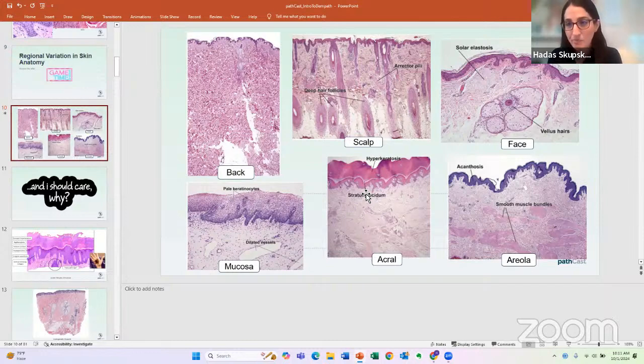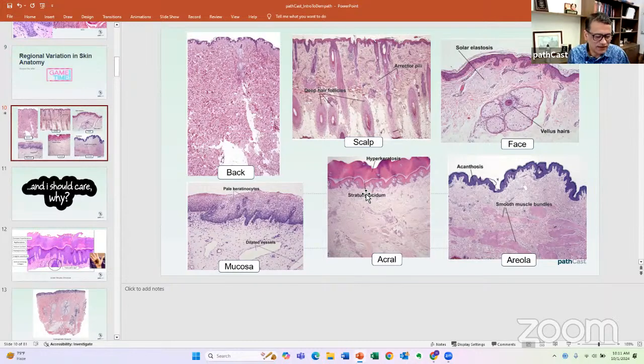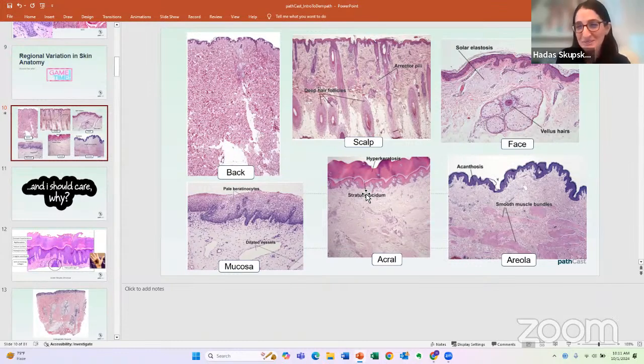Yeah. This last question for you is from one of our colleagues: I have great difficulty in identifying mild acanthosis. Any tips? I think that is interesting. This can happen to anyone. Yes, I think that's very relatable. I do too. Sometimes when I'm looking at slides, I'll say, okay, I think there's a little bit of acanthosis here, but it's hard to know if it might be site related, especially when I'm looking at a slide blinded.